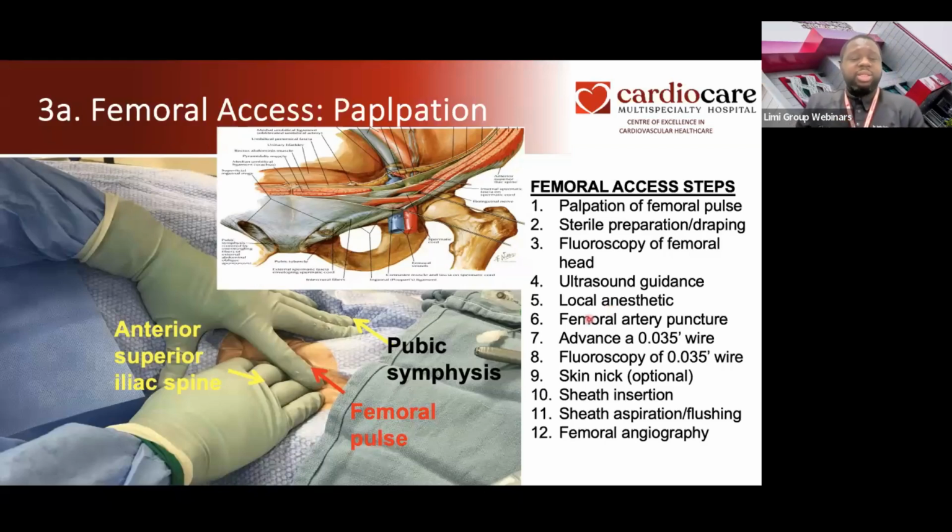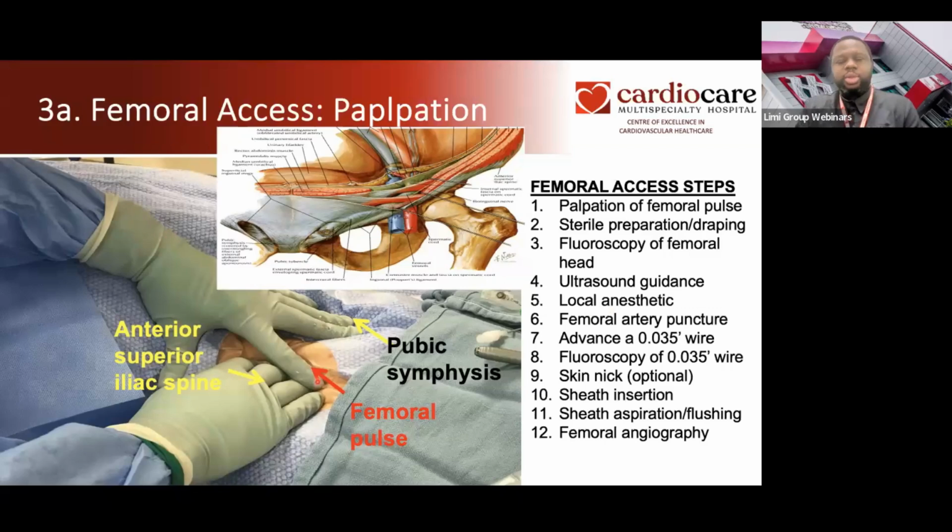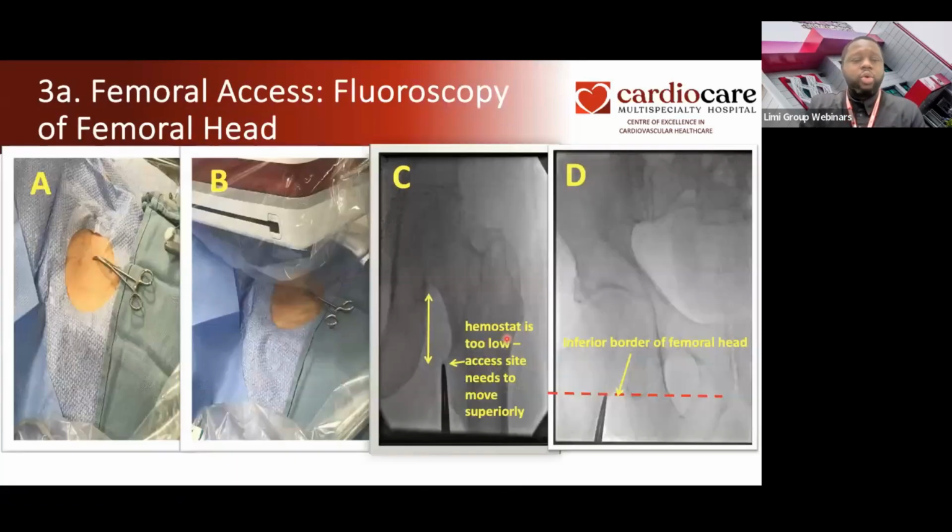As you can see, the patient is well draped. You've cleaned typically with iodine. It's a sterile procedure. You've felt the pulse and done your fluoroscopy. So typically we put a small artery forceps, put our fluoroscope head over it, and we see, because we don't want to puncture too low, like I said.